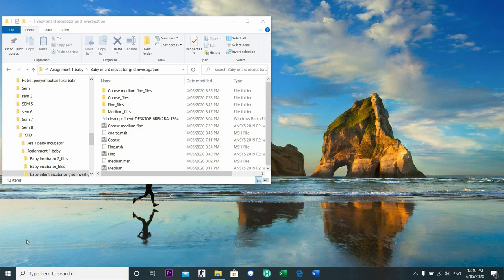And today we are going to study the incubator grid investigation. Today we are starting from the coarse. It's the adaptive sizing method for the meshing purpose.